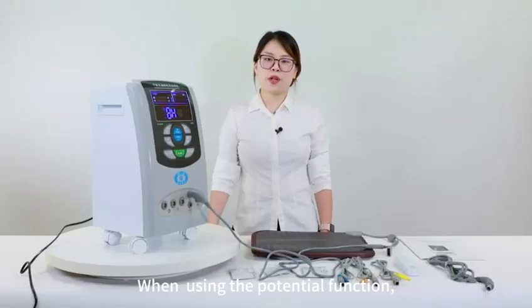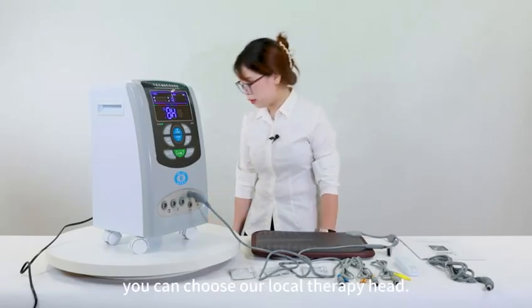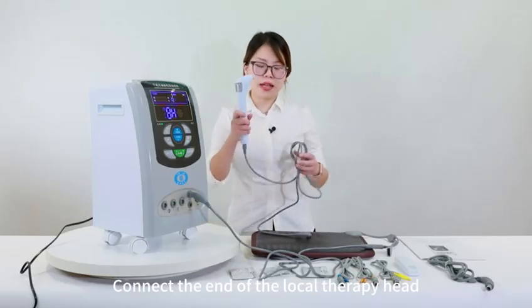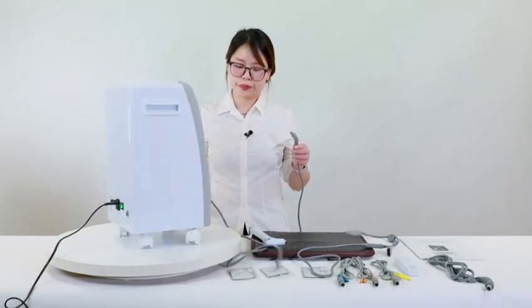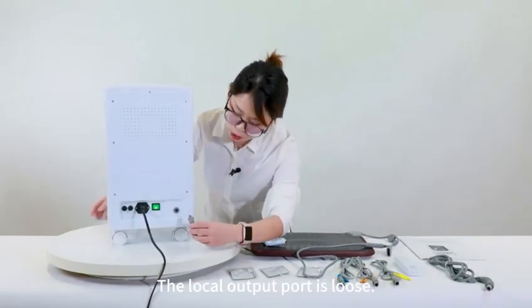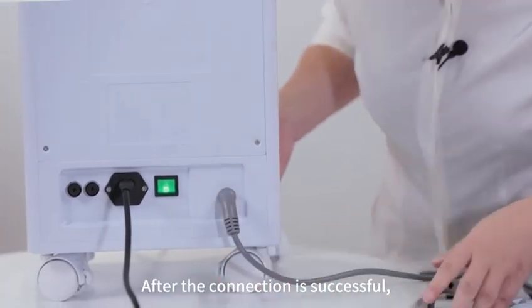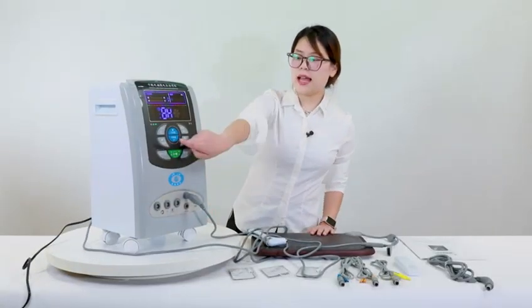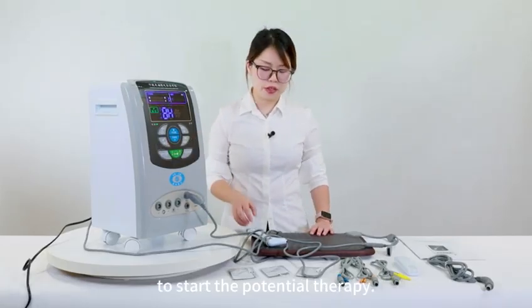When using the potential function, if you want to use local therapy, you can choose our local therapy head. Connect the end of the local therapy head to the back of the instrument, the local output port. After the connection is successful, click the potential key to start the potential therapy.